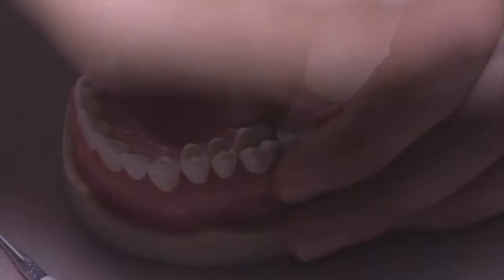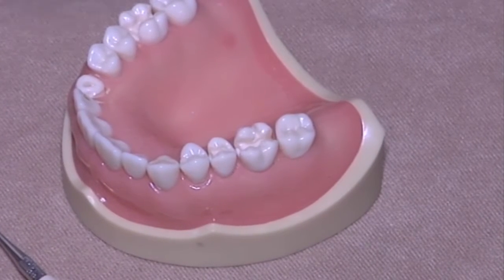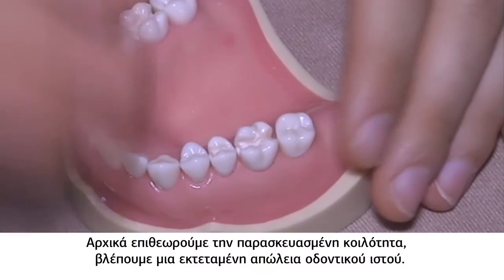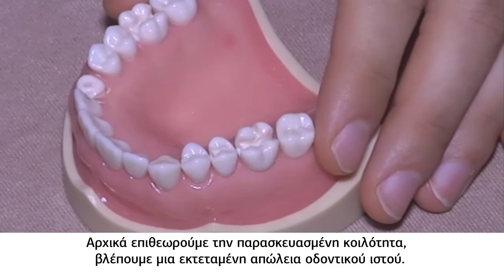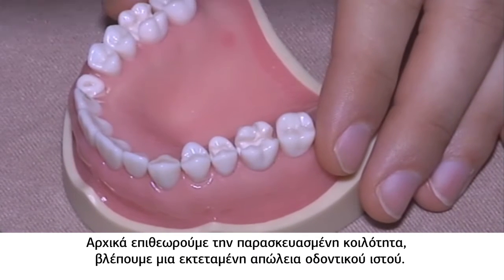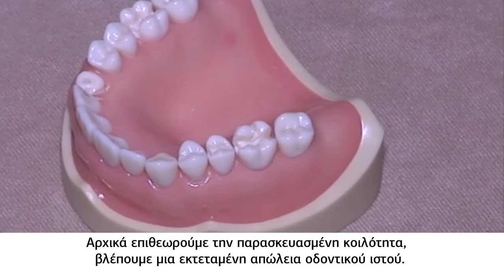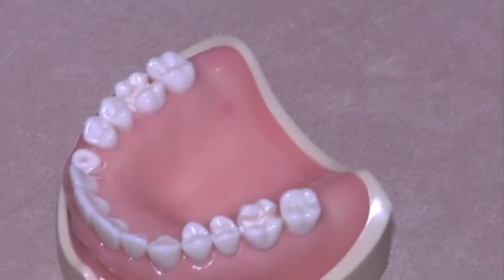And you're gonna see at the end that the difference in color will not be as big as you could expect, because it's not as in anterior teeth that the light passes through. In posterior teeth, the light cannot pass through because there is always tooth there. So I just have to remove my wonderful yellow glasses.